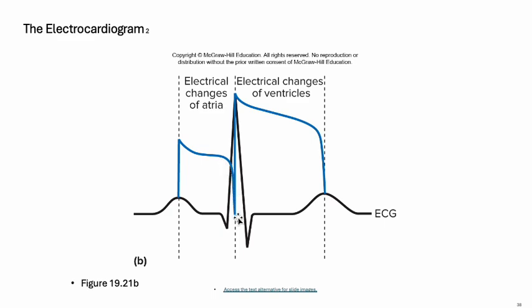And we said that atrial repolarization or relaxation is occurring at about the same time the ventricles begin to contract. And so you see that this is starting at about the time this large QRS complex is also starting. If we come over here to this larger blue one, we see the same thing. We see this depolarization coming up here, and this corresponds to the QRS complex. We have this ST segment.